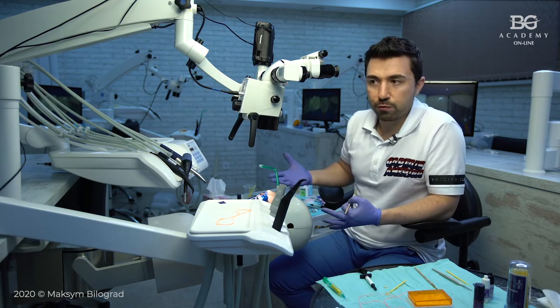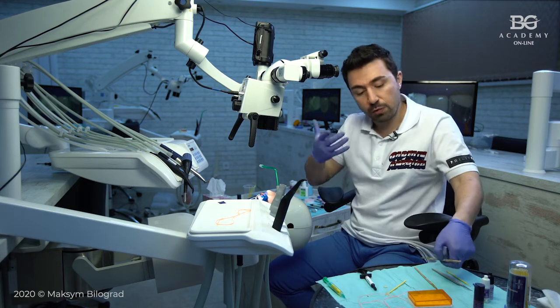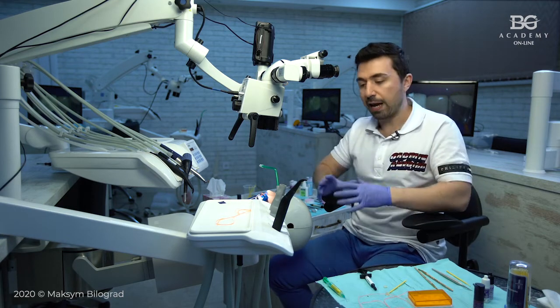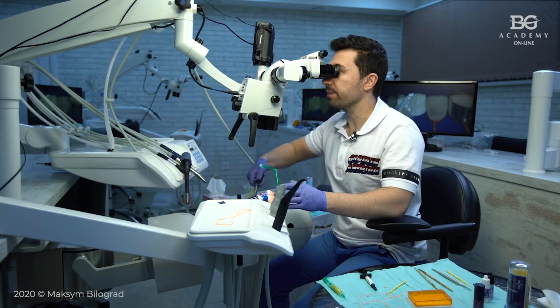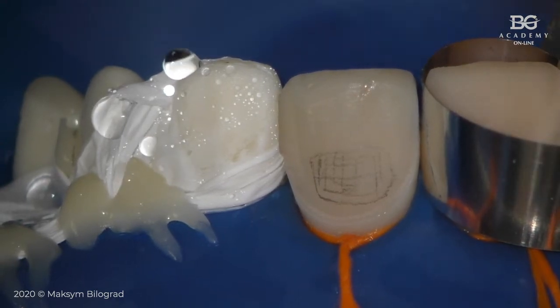Why do we need to etch filling? We will etch filling because of cleaning, just to clean the surface, and that's it. We don't need to etch filling, but theoretically it can be dentin that was exposed. In this case, if I'm using total etch systems, I have to etch my dentin. The best scenario is when you are not exposing dentin, definitely. We are not trying to expose dentin when we are doing sandblasting. This is not for exposing dentin, but it may happen. A little bit, but it may happen.